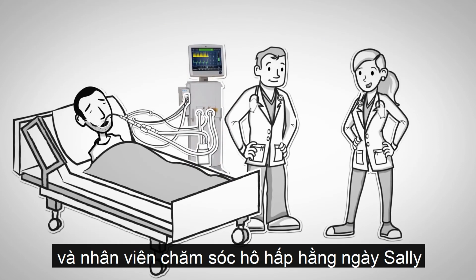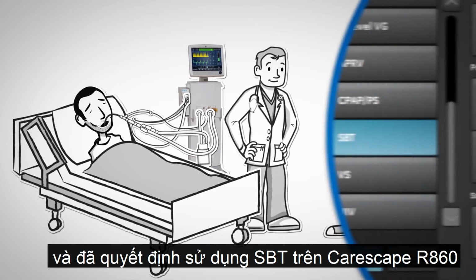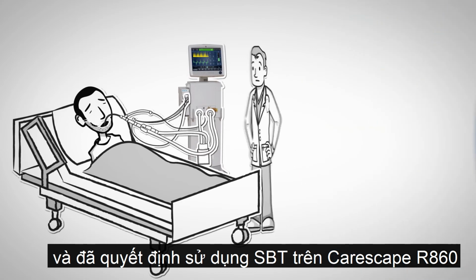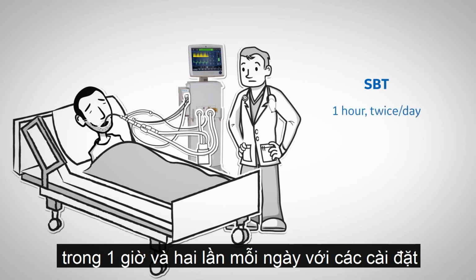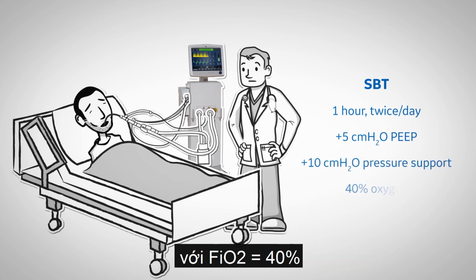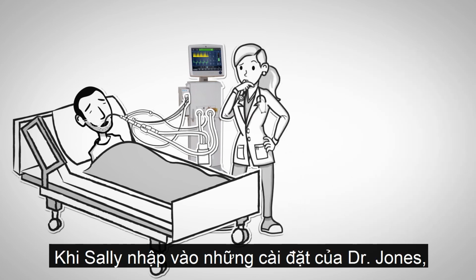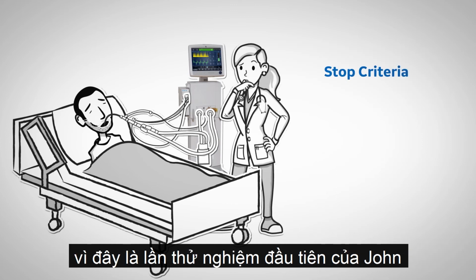Dr. Jones and John's day shift respiratory care practitioner, Sally, have decided to assess John's ability to breathe spontaneously and have decided to use the spontaneous breathing trial on the CareScape R860. Dr. Jones writes the order for SBT for 1 hour, twice a day, with the settings of 5 centimeters of water of PEEP and 10 centimeters of water of pressure support with 40% oxygen. As Sally enters Dr. Jones' settings, she also considers the stop criteria needed since this is John's first trial.